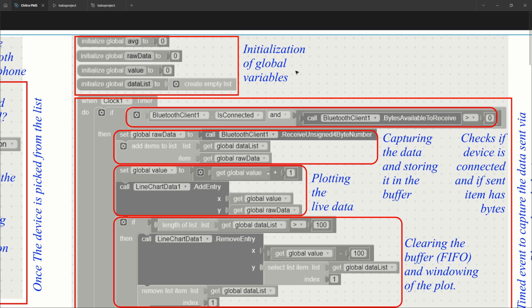So according to that, we found out the frequency, and according to the frequency, sampling has been taken to be 4 to 5 times the frequency of the signal. So for us, the frequency of the signal will lie from 0.25 hertz to around 3.3 hertz, and we safely took the sampling value to be 20 hertz. So we'll be having 20 samples per second, which means every sample will be given every 50 milliseconds, right? So the gap between two samples will be 50 milliseconds.